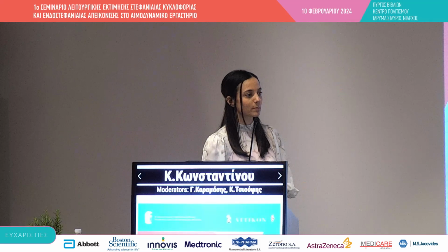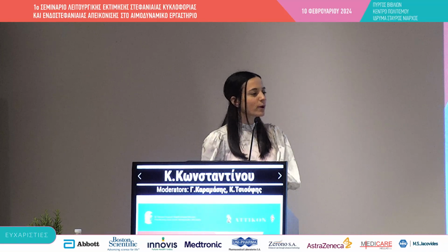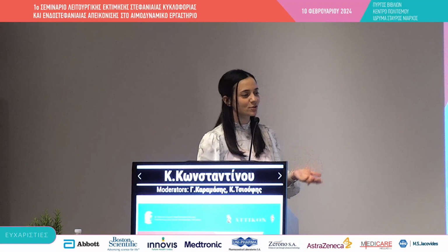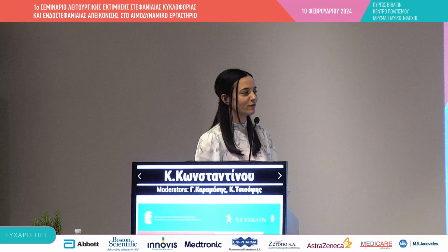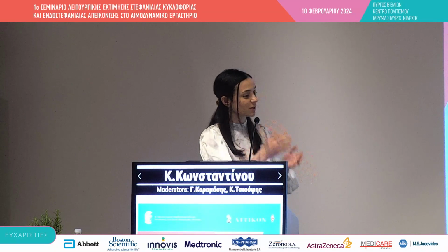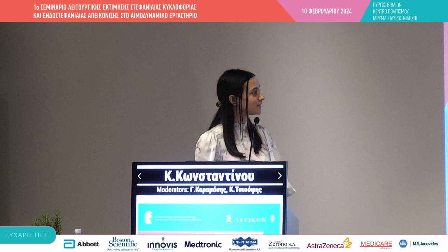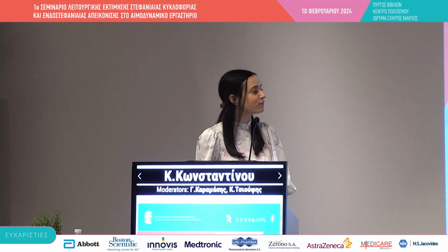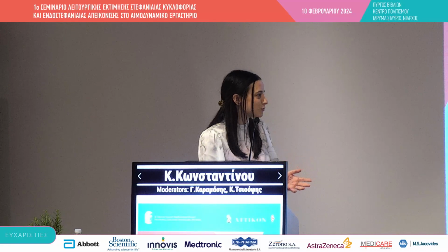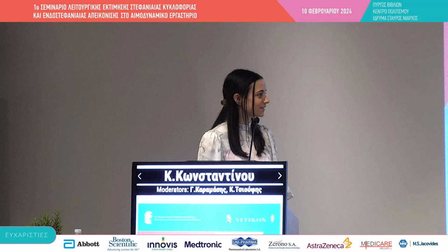We tend not to give it, but we had a patient the other week. Normally we try and stop all medications before they come in for at least 2 days. But when we stopped this lady's verapamil, she developed bigeminy. So when she came in, we couldn't do the assessment because she had ventricular bigeminy. So we had to bring her back on the verapamil and did the assessment on the verapamil, and it was still very abnormal. So I'm sure you can give a small dose of something if you have to. If someone has a significant abnormality, you still see it.